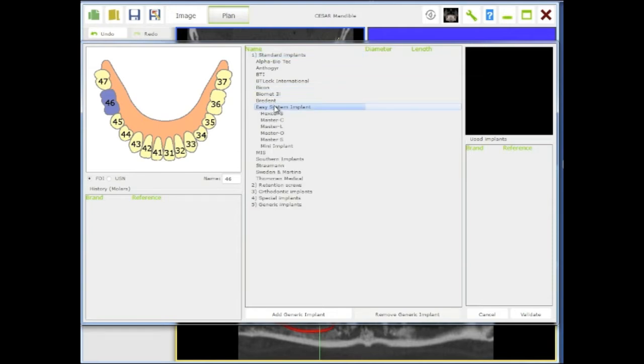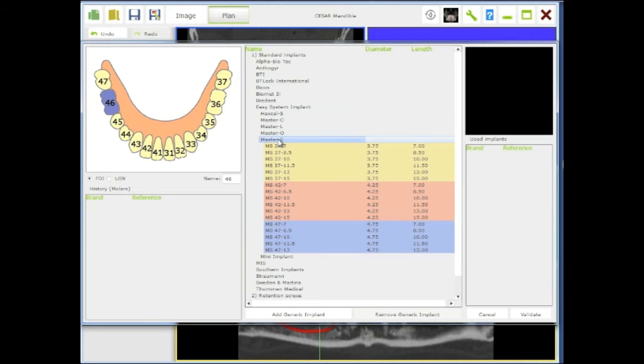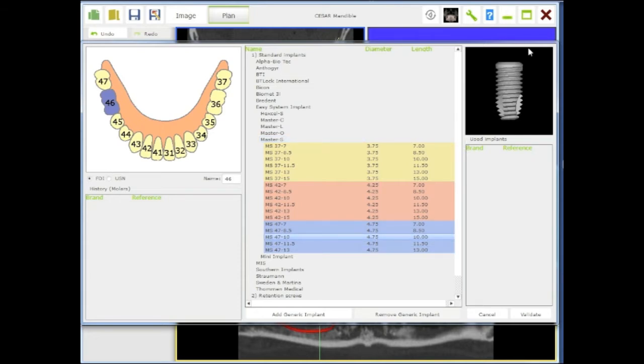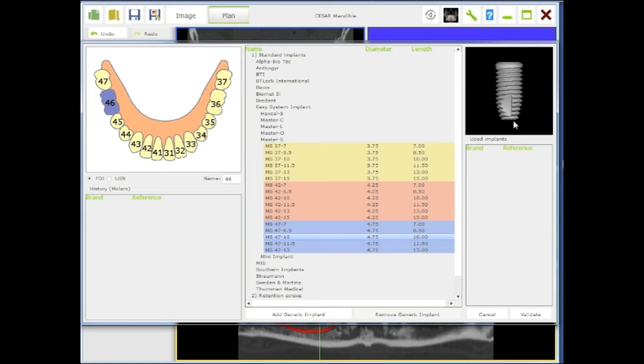I click here, I go to standard implants, I select my favorite implant brand, my favorite implant family, and the size. It's a big tooth, so in this case I will choose something like 4.75 by 10.